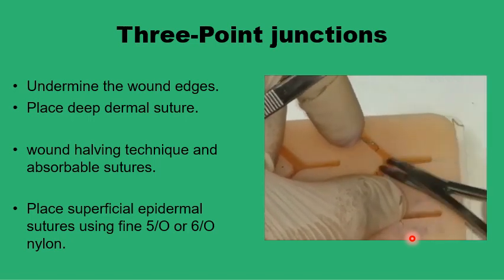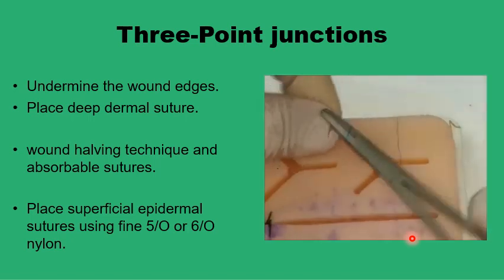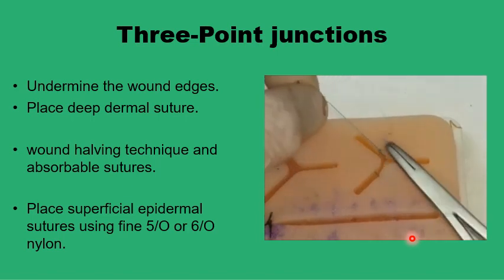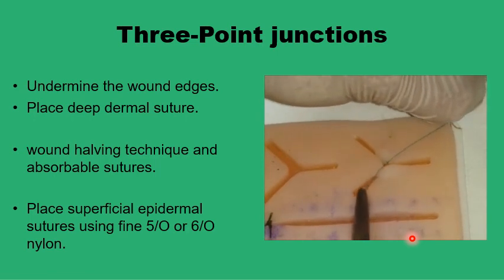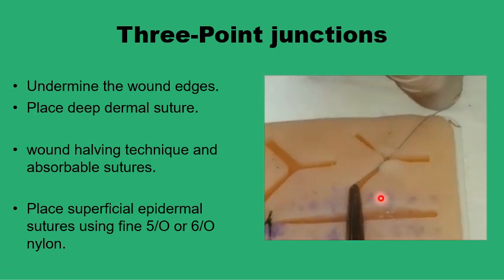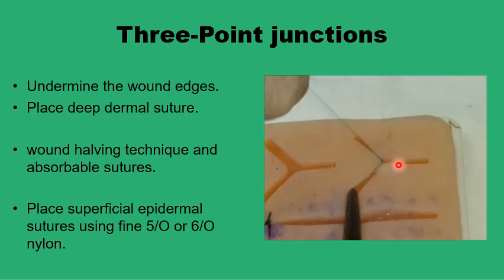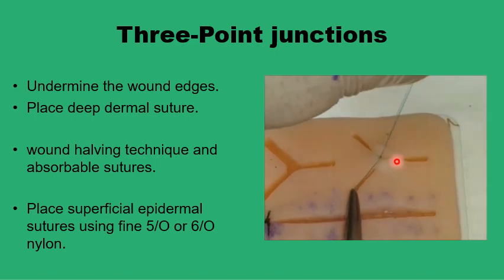Once you have these three bites and the three angles, you can tie your knot in one direction and then the other, bringing about a very good approximation of the three points without having any sutures on the surface. This prevents compromising the blood supply of the angles, which is already decreased.